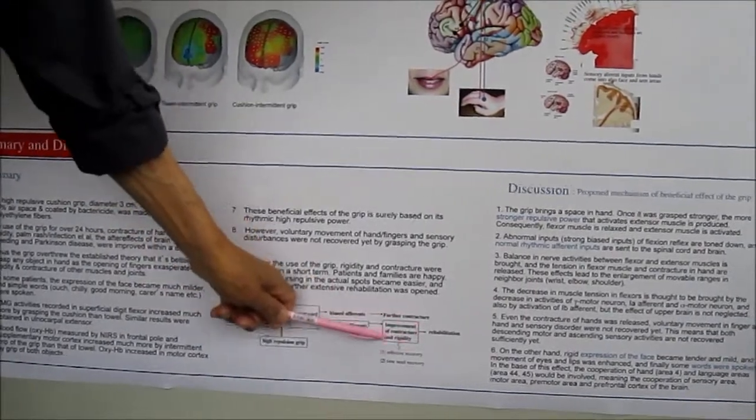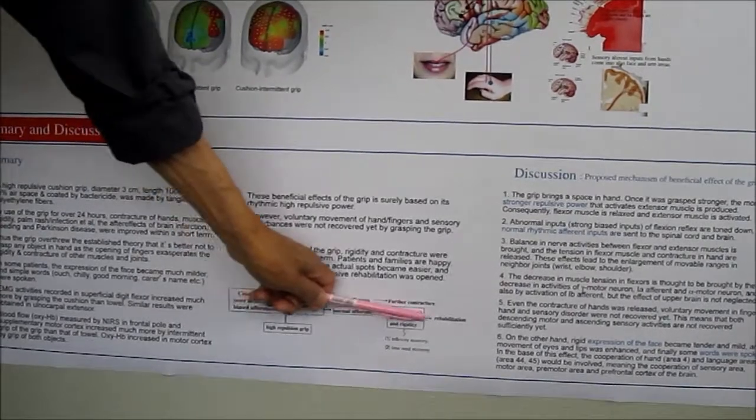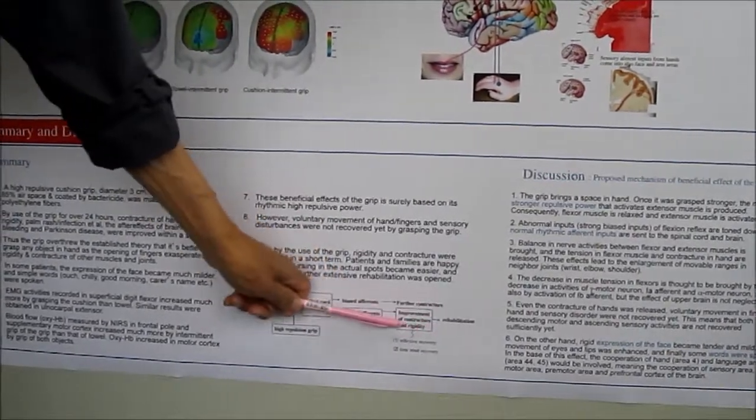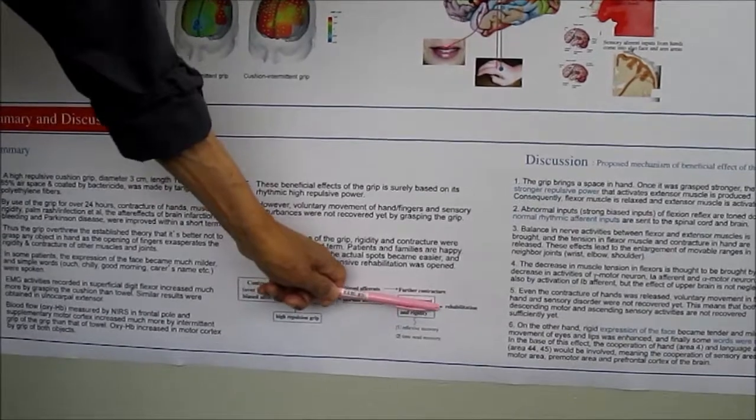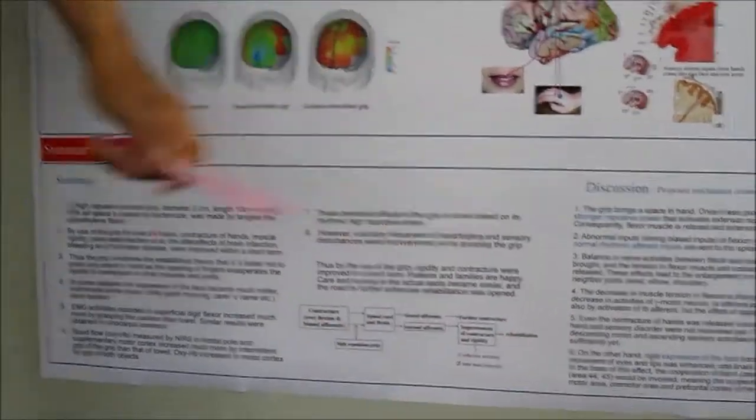Then improvement of contracture or the decrease of the muscle tonus was obtained. So we opened the road to further rehabilitation.